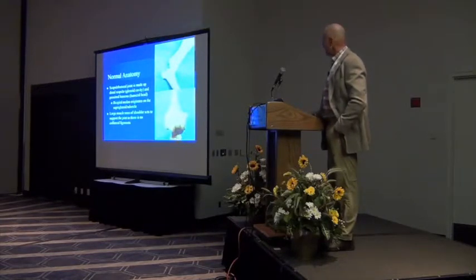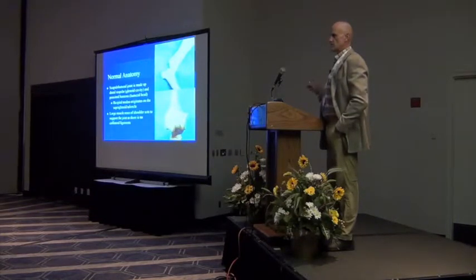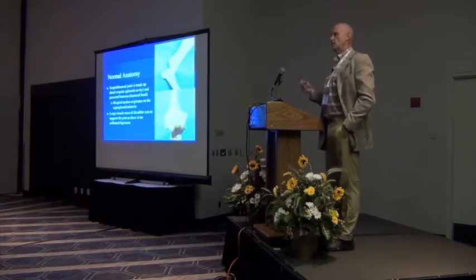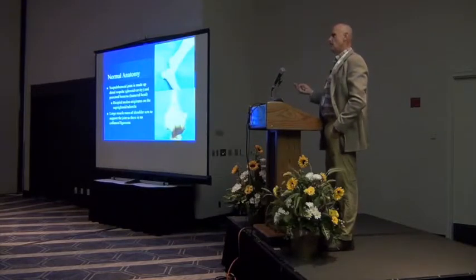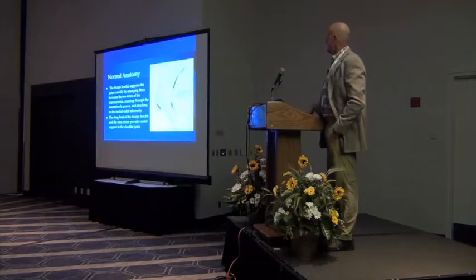And if you can take that into consideration, it really depends on how you're coming across here. Now, the other side of this whole deal is when you're taking a radiograph, what are you trying to do? You're trying to pull the leg forward and take a medial to lateral, and we'll get into that a little bit later on. But if this horse is lame in the shoulder, it's sometimes problematic to get them comfortable enough to get that out and then catch that projection just like you want them.